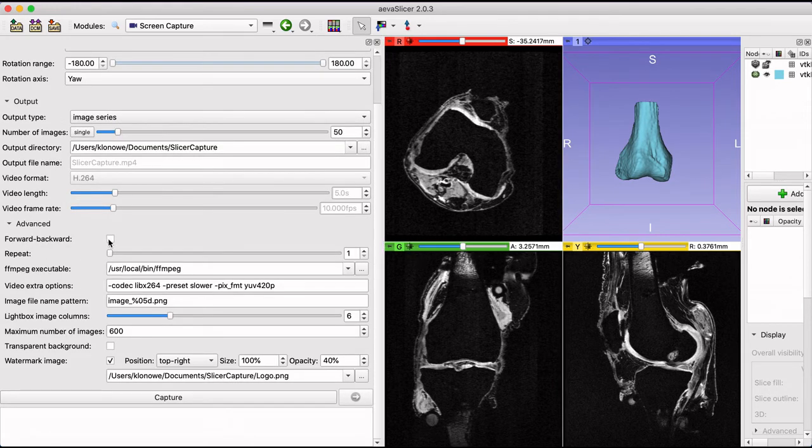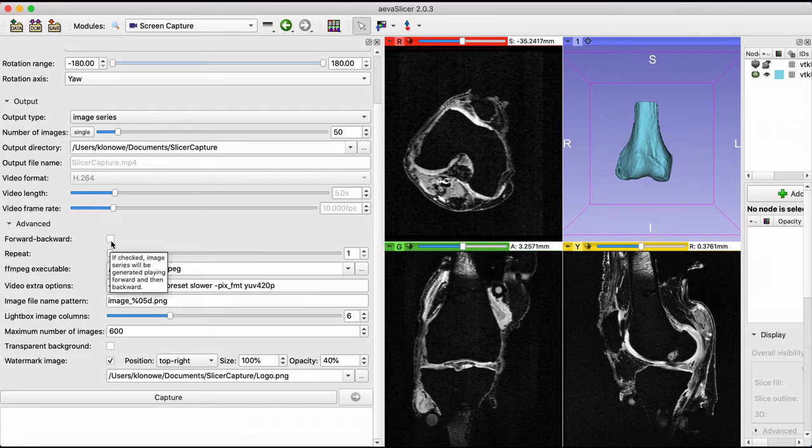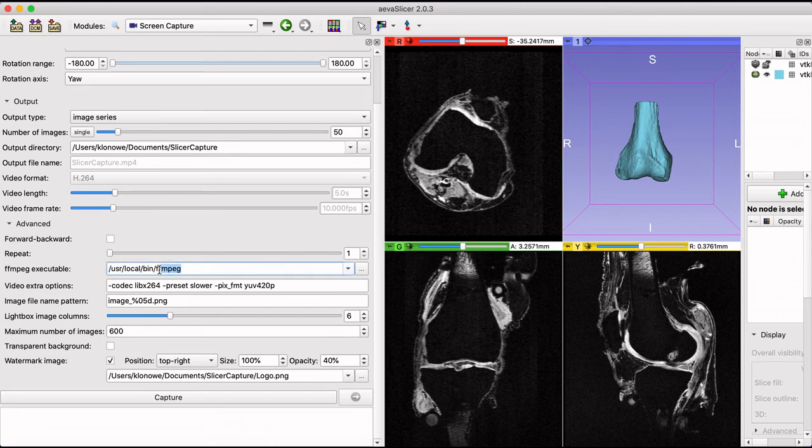A useful feature in the advanced settings is the option to add a watermark to the output image. Save the watermark image as a PNG file and specify its path in the window.